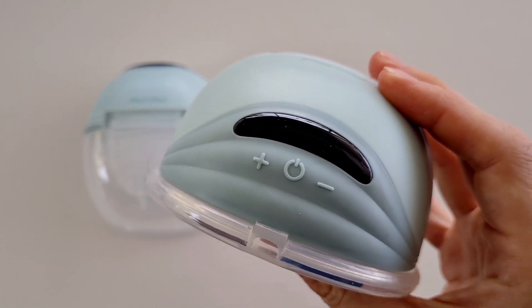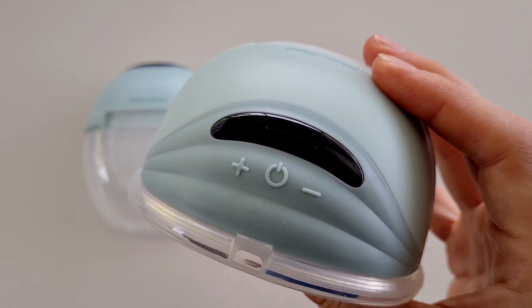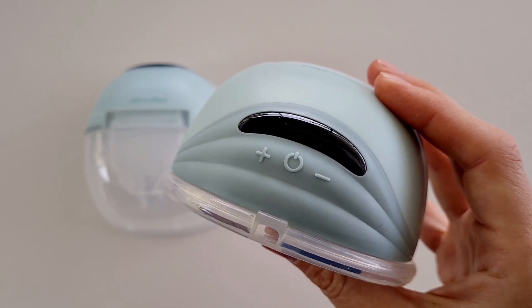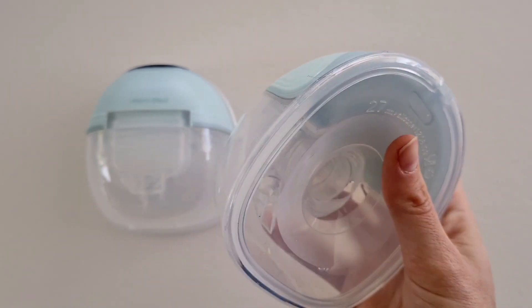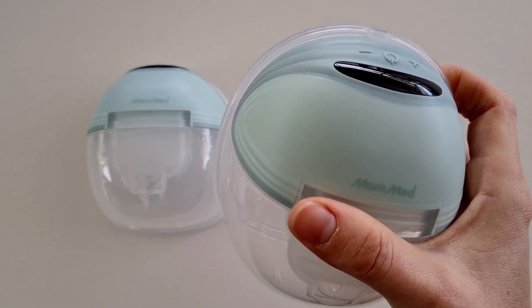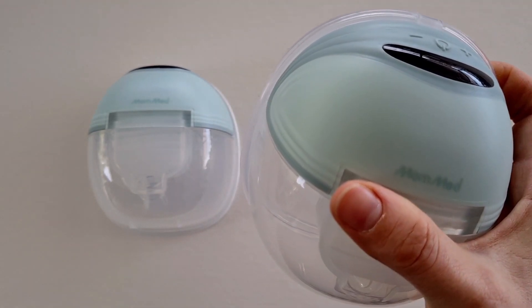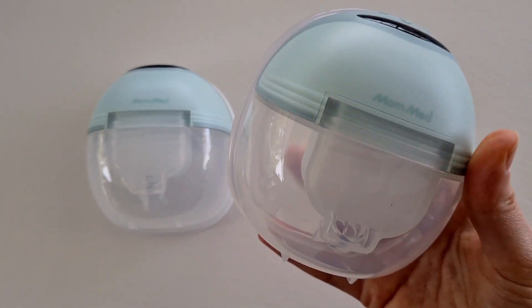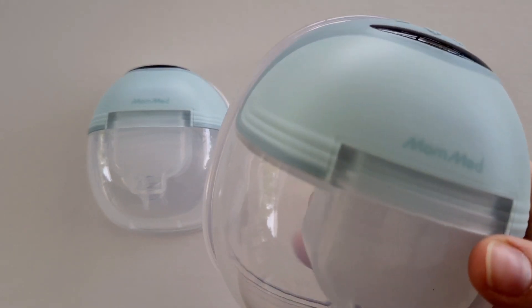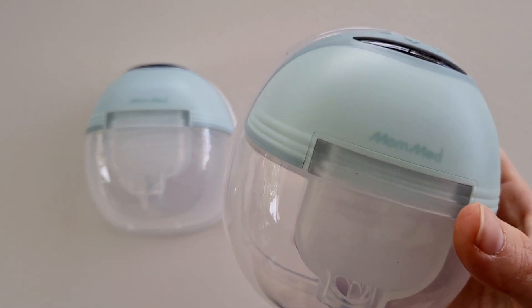Speaking of modes, there are three different modes. You have massage and expression, which are your typical modes that you'll get on a breast pump. But you also have a great auto feature, and I love this — with the auto feature you can just pop the breast pump into your bra and let it go if you are not wanting to fuss around with all the different suction levels and modes. Suction strength is 200 to 300 millimeters of mercury, which is really powerful for a wearable breast pump.